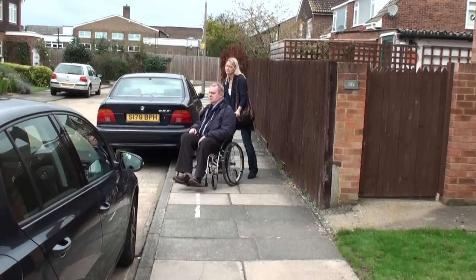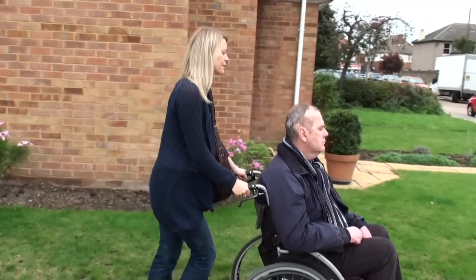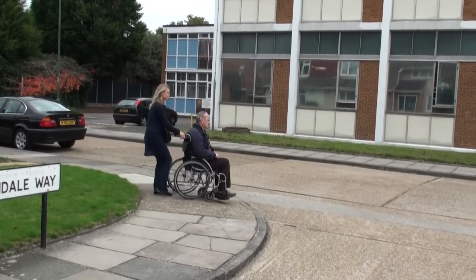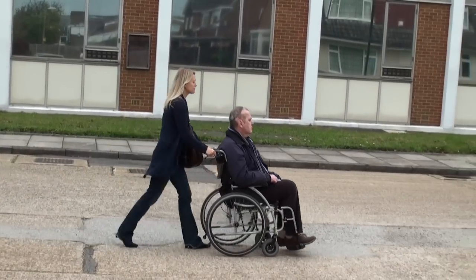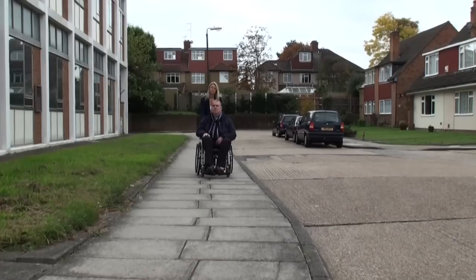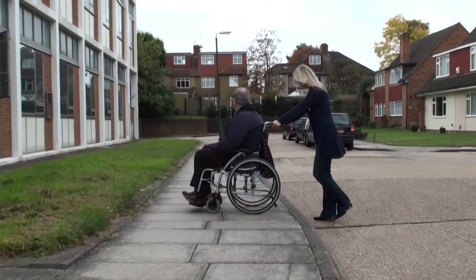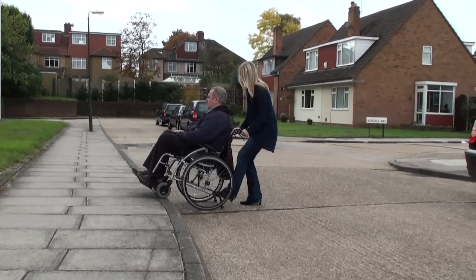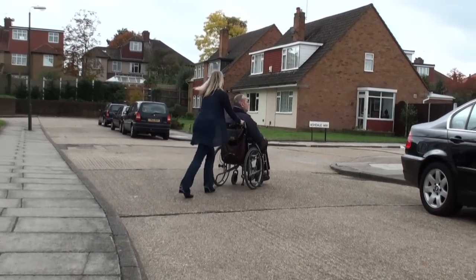When crossing a road, look for the nearest dropped kerb. Some dropped kerbs are smoother than others, so always slow when pushing the wheelchair over these. If there aren't any dropped kerbs and you are sure you have the strength, then you can perform a kick tilt. Try to avoid going down the kerb forwards as this would throw a person out of the wheelchair. Instead, reverse the chair slowly over the kerb and down, using the handle brakes to slow the descent.